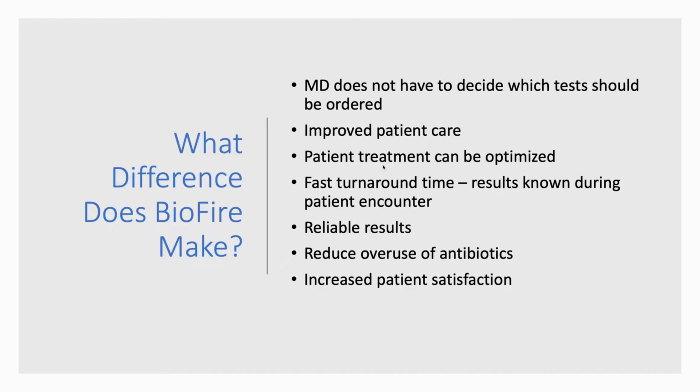Right? We know we're going to get reliable results. You saw the sensitivity and specificity in the previous slide, right? And we can reduce the overuse of antibacterials. And you can't underestimate the patient satisfaction. To be able to say, hey, we did the lumbar puncture, and within 2 hours, we're able to tell you I identified a pathogen.